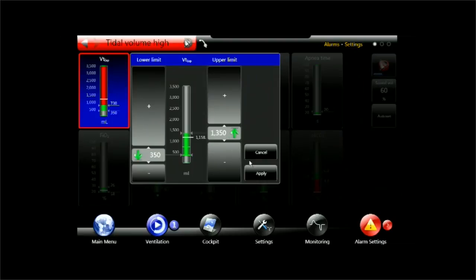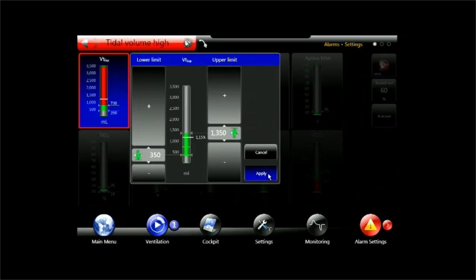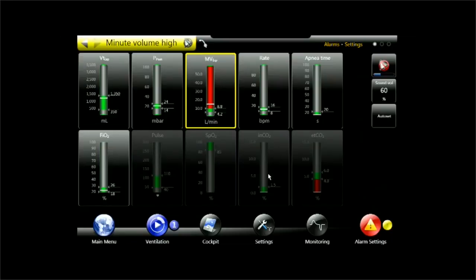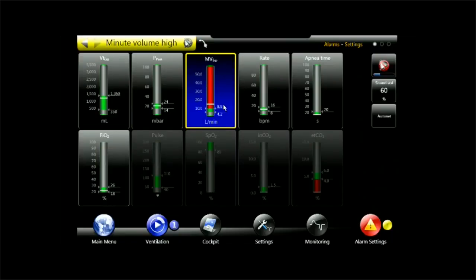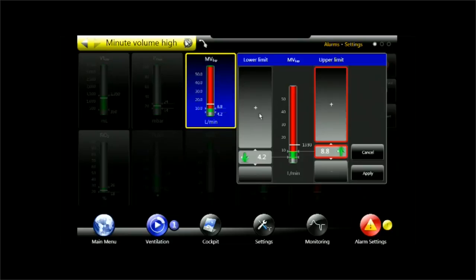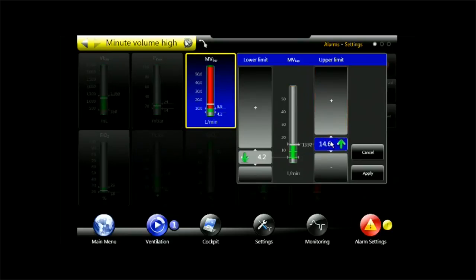Alternatively, I could also adjust my inspiratory pressure or my tidal volume settings which would bring this one down. So I always have two possibilities. Either change the settings or change the alarm limit. For the sake of the moment, I will adjust the alarm settings.